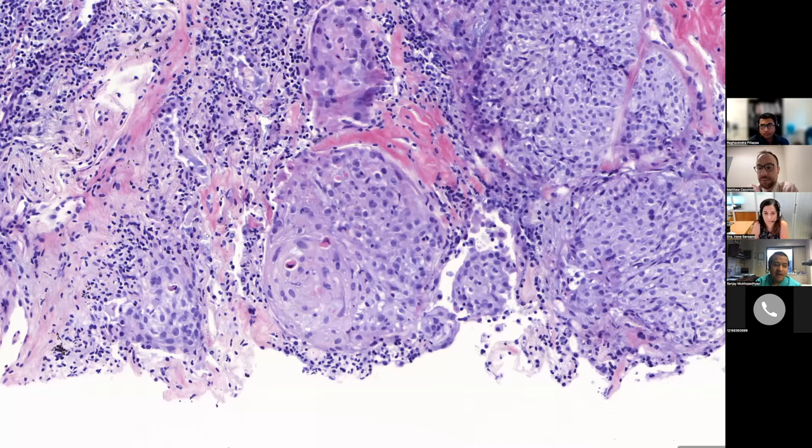And if you have to explain, Matt, to a first year resident, why you didn't do the stains, like why this is squamous, how would you explain? Yeah, so it's got clear squamous differentiation, and I think we were just describing the dyskeratotic cells, the intercellular bridges, for what that's worth, and then the absence of glandular differentiation. If I did see an area that had more glandular differentiation or potential glandular differentiation, then I would do the stains.